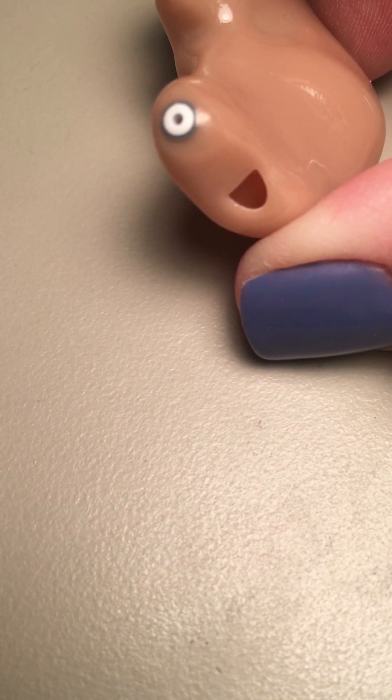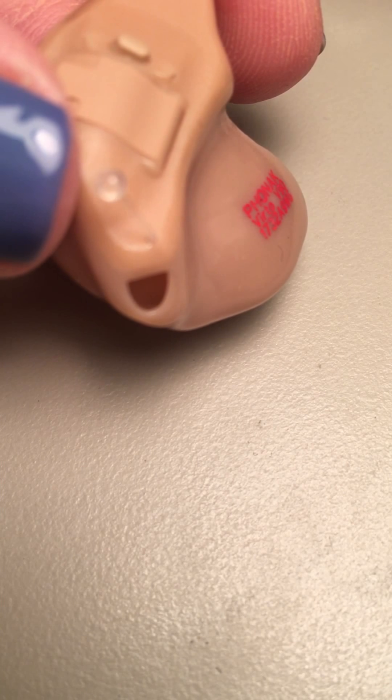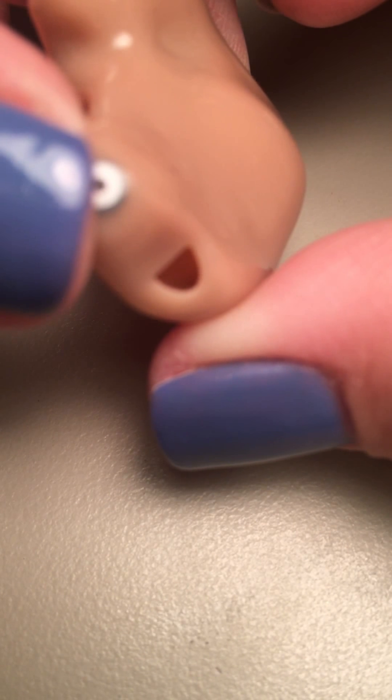This end is the part that goes in the ear. You have kind of two holes here. You have this smiley-face sort of hole that is a vent, and if you look at it, it goes all the way through the hearing aid and comes out on the other side. That is to let the person's voice out of their ear and also to keep natural sounds coming into the ear naturally.